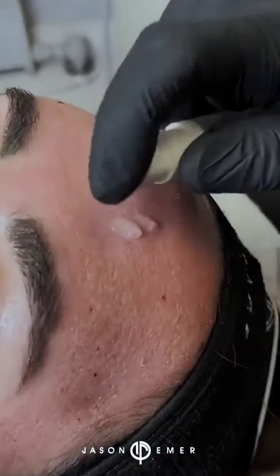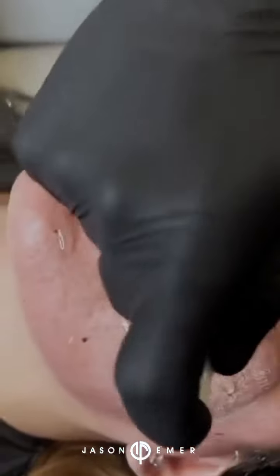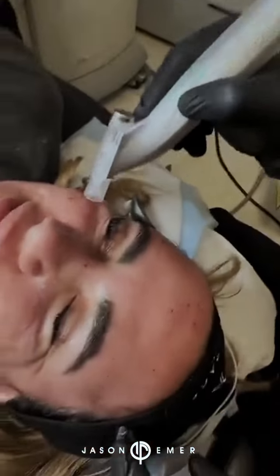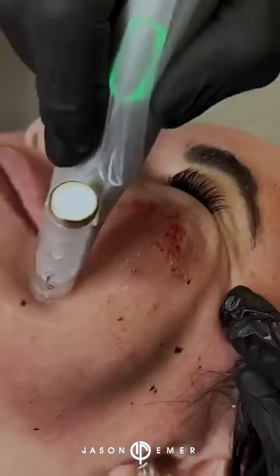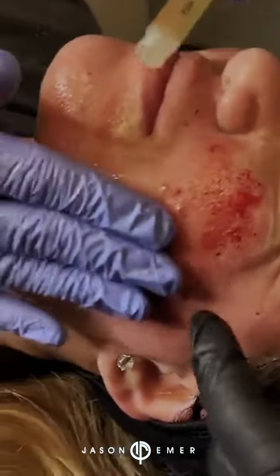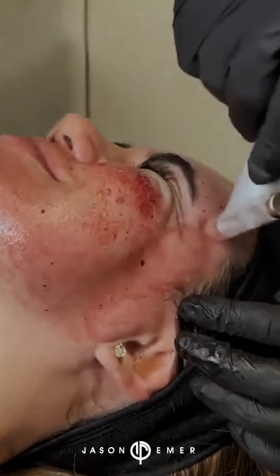Now we're going to do the microneedling. We're going to cover her face with hyaluronic acid. So typically we use Hyla B from Emer Skin. We're now using the Eclipse micro pen. So where she has the deepest scars, we're going to do some of these pinpoint bleeding. You guys can see, this is going to help the PRP and the Emer Skin Hyla B get into the skin. Other than the PRP, you guys can see the growth factors, the clear, yellowish clear liquid.